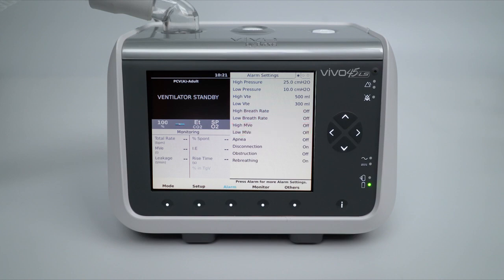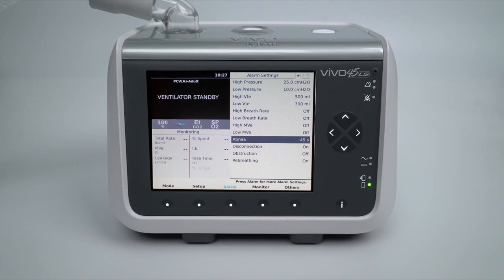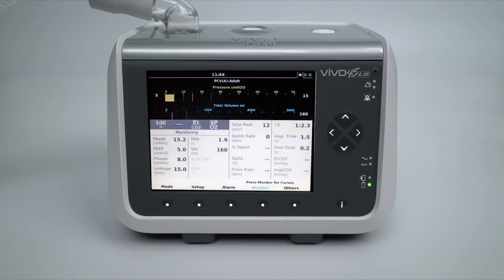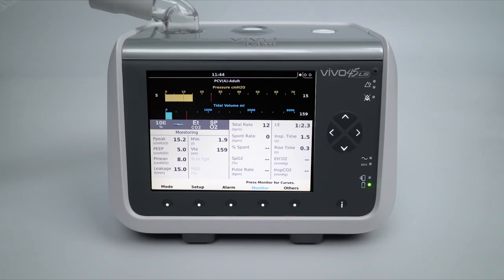The next alarm is the apnea alarm. When the Vivo 45 LS does not recognise spontaneous effort from the patient for a set period of time, the apnea alarm will be triggered. The apnea time settings are from 5 to 60 seconds. For example, if the apnea alarm is set for 5 seconds and there is no recognised spontaneous breathing effort from the patient for 5 seconds, the apnea alarm will be activated.